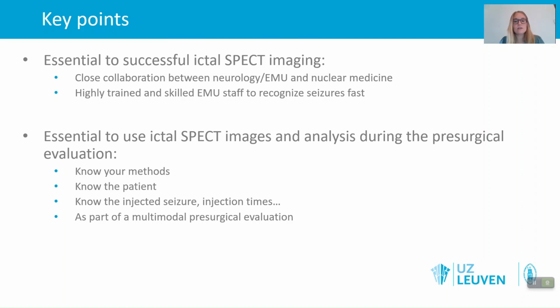If based on all of this you might not come up with a clear hypothesis on where the possible epileptogenic zone for this patient is, you can also use these SISCOM images. It will help you to have a hypothesis or an implantation strategy for invasive monitoring. But this also, again, in the full multimodal workup.